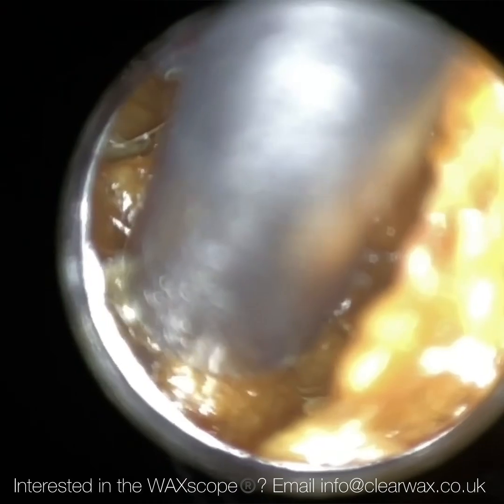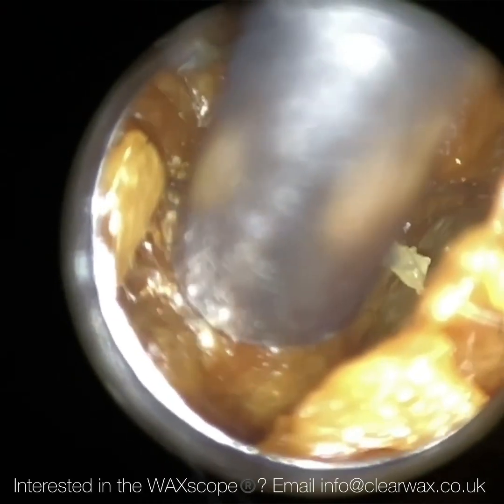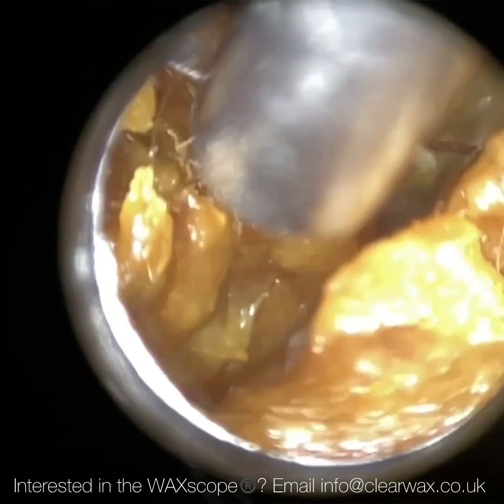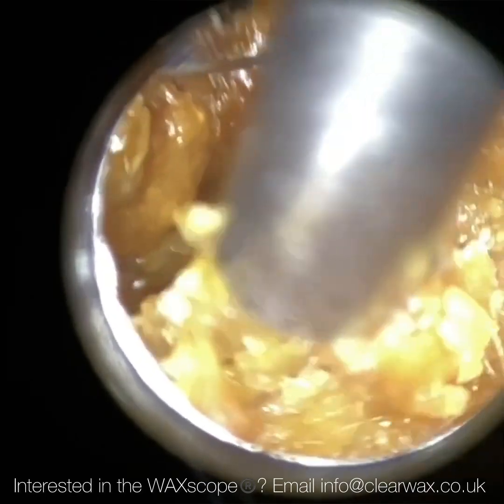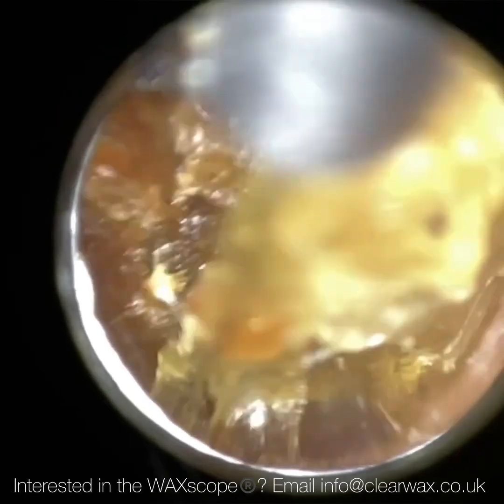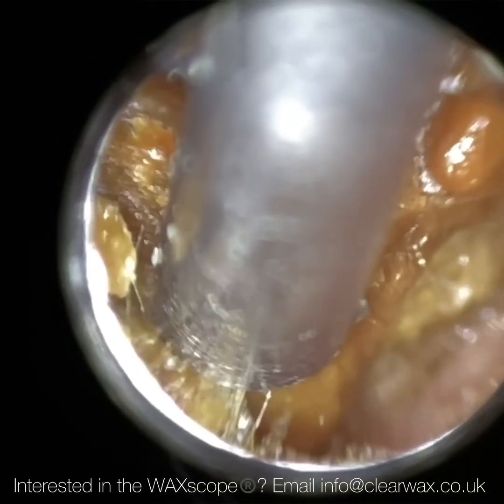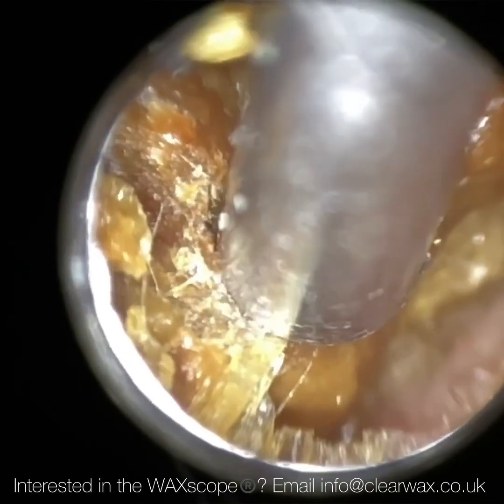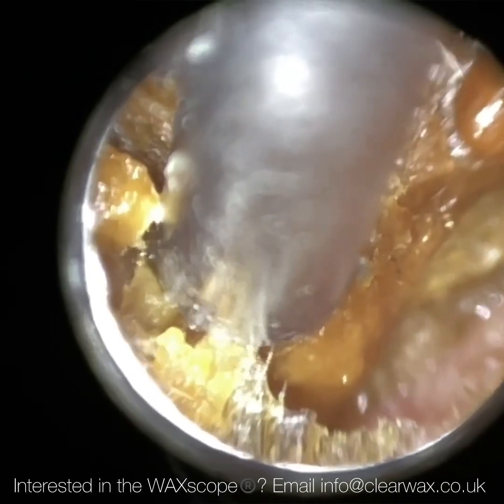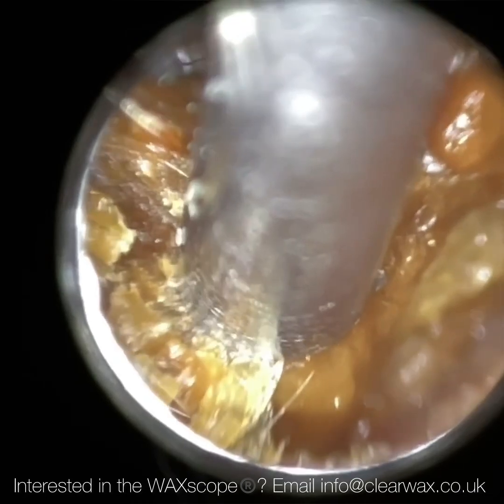Hopefully that little clip can really hammer home the message as to why I've developed the Waxscope. Over the last year, as I've been presenting the Waxscope, I have had some kind of nasty comments about the optics and how much more people prefer the endoscope. Well, I do know the difference between the views because I also developed the iClearScope endoscope, so it's not that I'm not aware of the difference in view. You can't compete with an endoscope in terms of optics because the lens goes inside the ear.